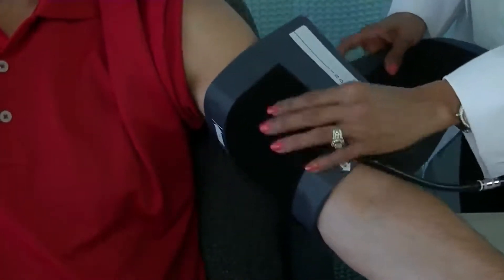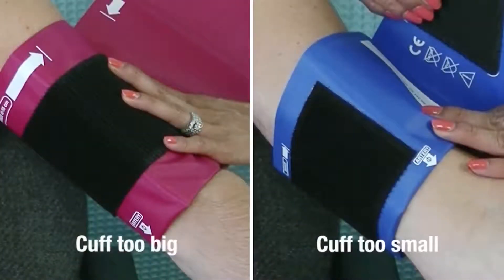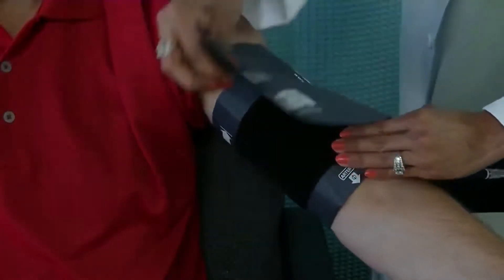When ready, place the cuff around the arm. The cuff index line should fall within the printed range markers. If not, select a larger or smaller cuff to ensure an accurate reading. Make sure the arm is relaxed and supported and ask the patient to stay still and quiet.